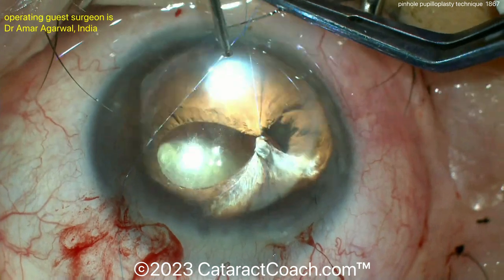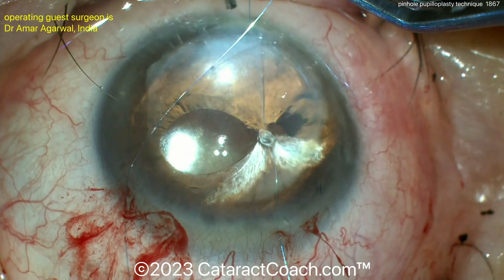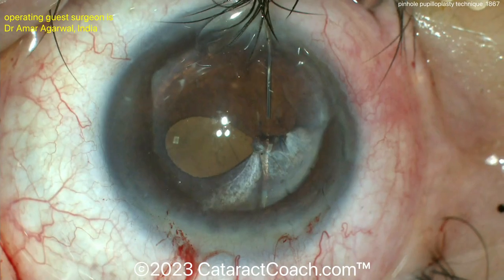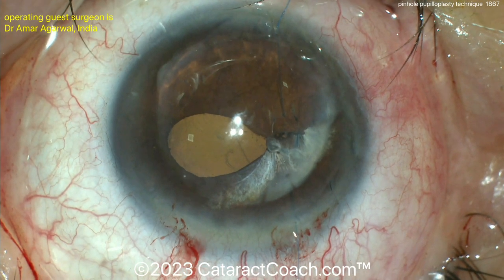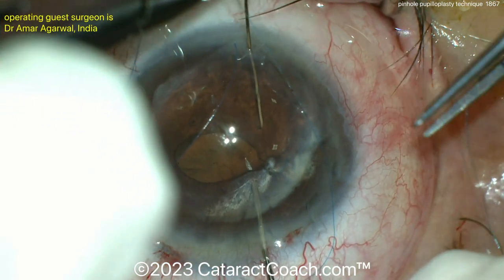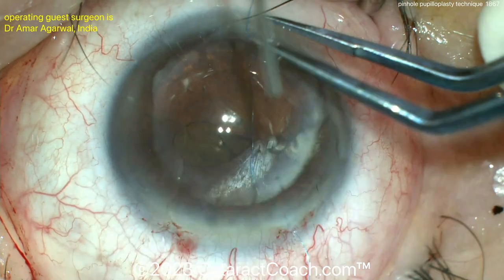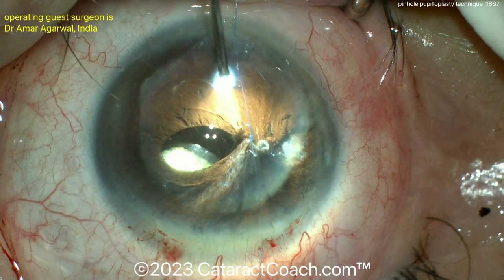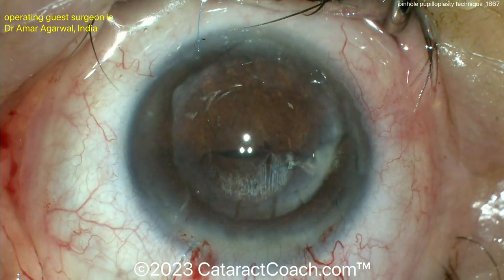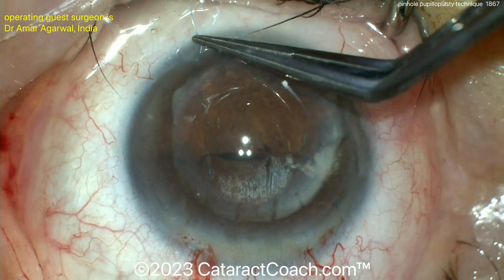Beautiful. In this technique, Dr. Agarwal is doing just one throw of four loops. Now passing another one — you have to close up all these defects. It's going to take a little bit of time, but taking your time and being meticulous is all you need to do. Passing that suture through with an extra light pipe makes it really a lot easier to see things. That's a really nice technique. Now you have a closed-up iris, sutured shut.